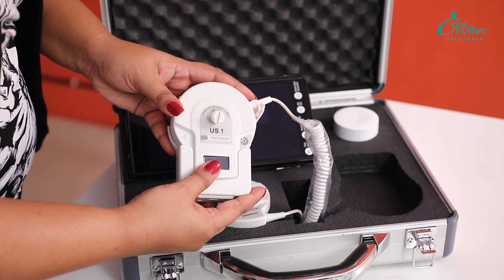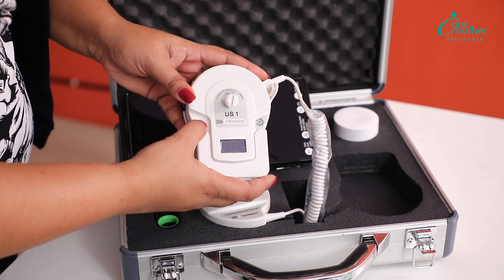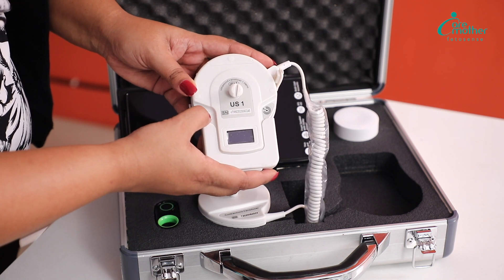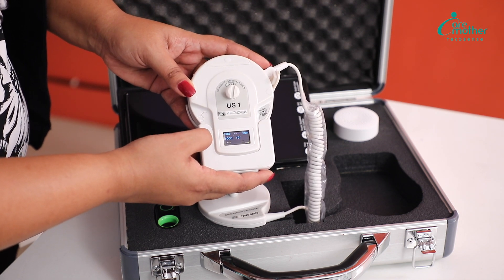This is the FHR probe, or the fetal heart monitoring probe. This is going to be used to monitor the baby's heartbeat. To switch it on, you have to give a long press to a small button which is here. The screen comes alive, which means this probe is ready to use.